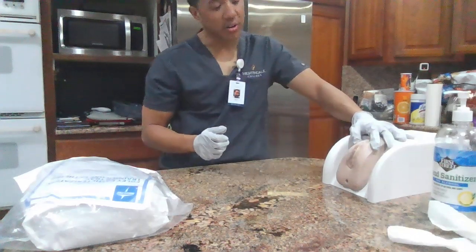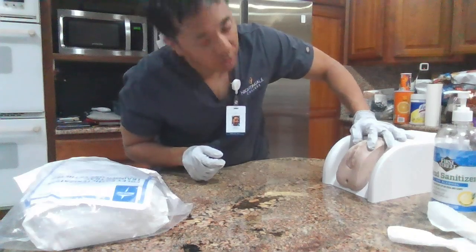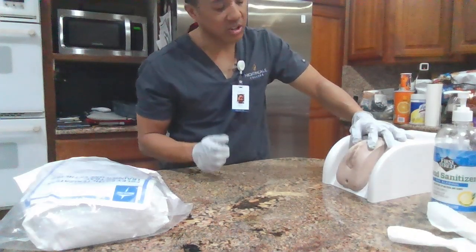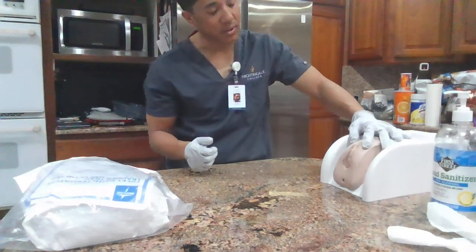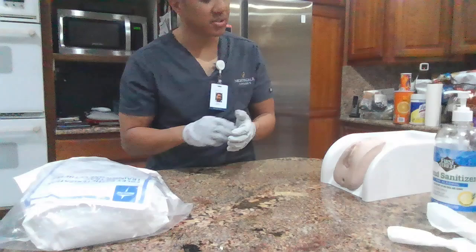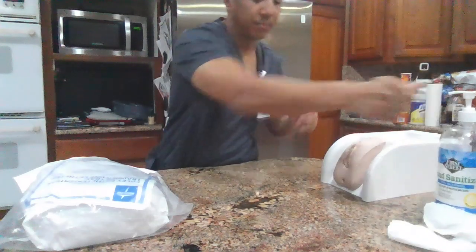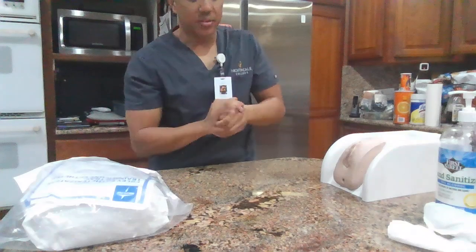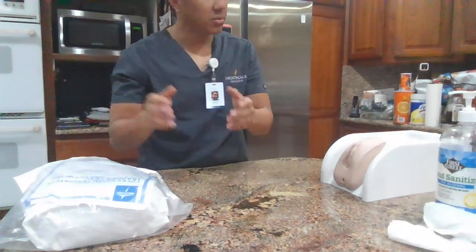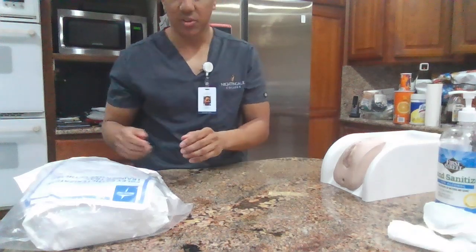I'm also going to check her anatomy for the opening of her meatus, and I'm also assessing for any discoloration, discharge, or malodor. Okay? All right, Mrs. Smith, I am now going to perform the sterile part of the procedure. I'm going to remove my gloves and perform hand hygiene. And this is a sterile procedure. I am going to place the Foley catheter between your legs. If you can do me a favor, please do not move or touch while I'm doing the procedure, okay?